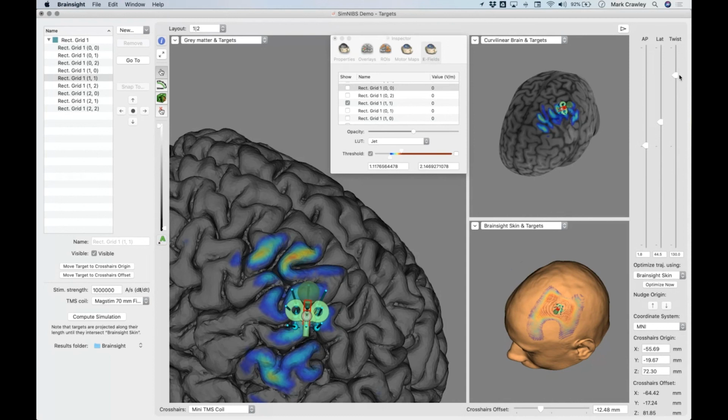And then there's one which I answered in the questions, and it's where and how do you perform MRI segmentation? In the questions, I have put a link on that contains documentation on how to segment an MRI scan in the terminal on Mac, Windows, or Linux. Cool.